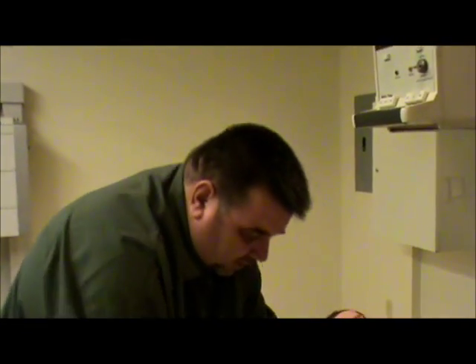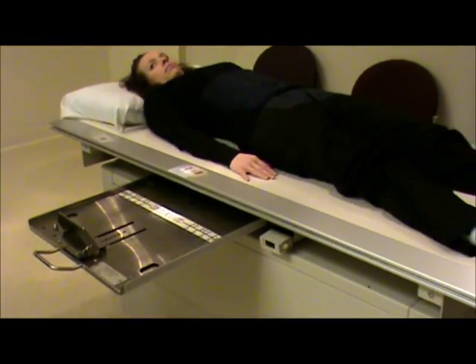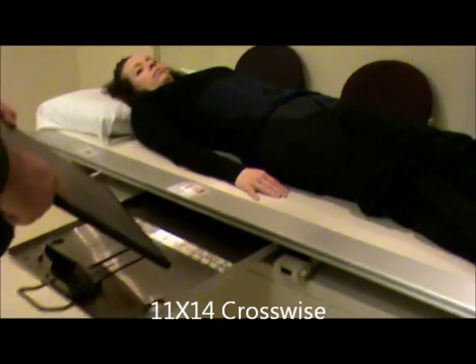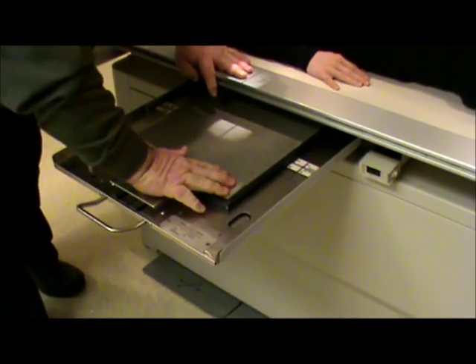Once we've taken the scout, we're going to do our tomogram. We change films and use an 11 by 14 crosswise. When doing tomograms, not only do you use your regular marker, you also need a separate marker to indicate what cut you are doing after measuring with the caliber. I'll go ahead and put the marker on.